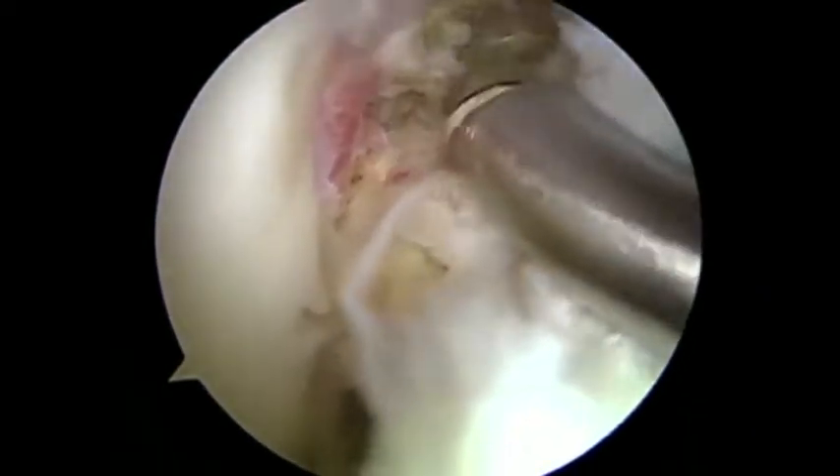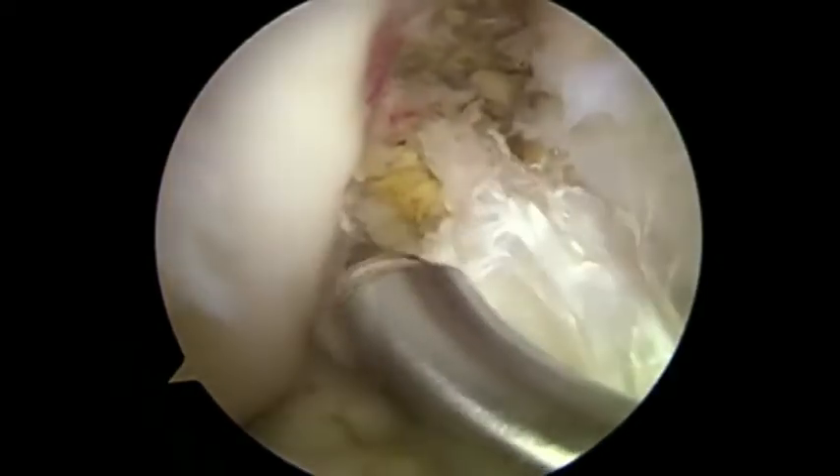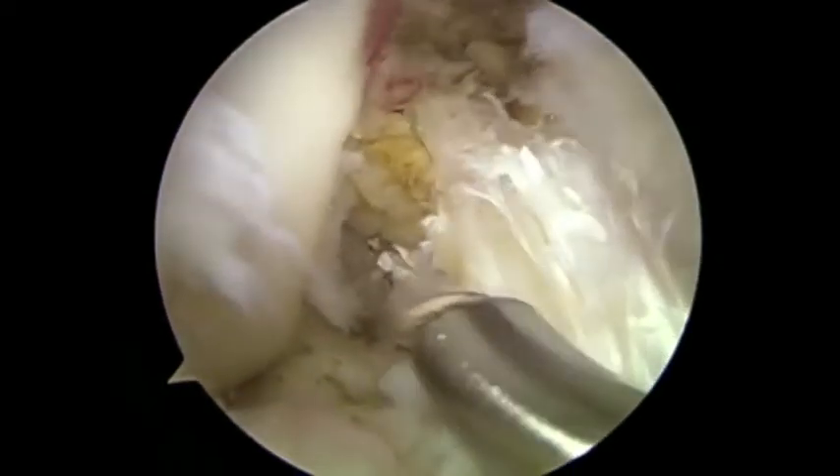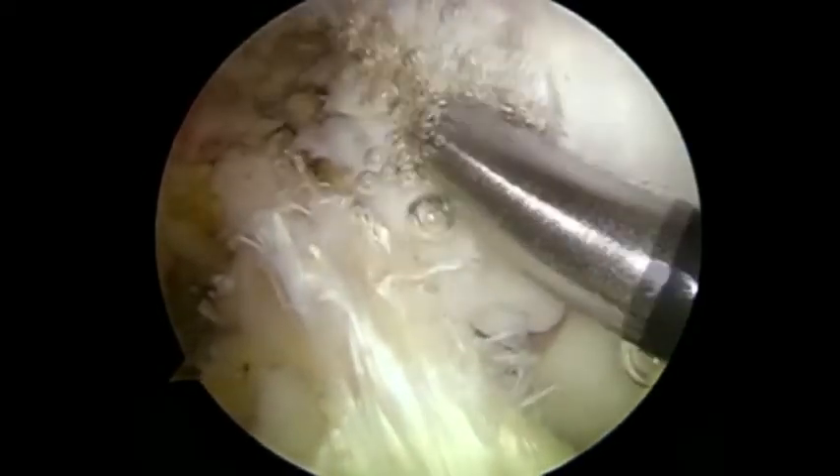Hemostasis can also be undertaken at the same time using radiofrequency ablation. The radiofrequency ablation probe is essentially used to take away the peripheral fibres, reducing the diameter of the ACL.